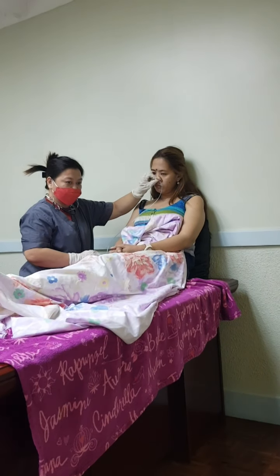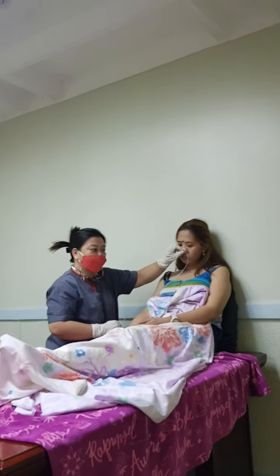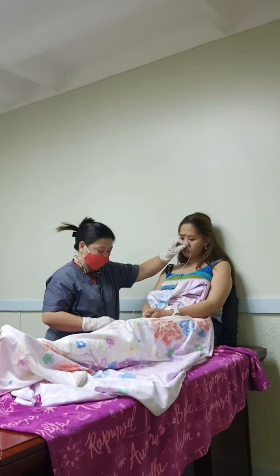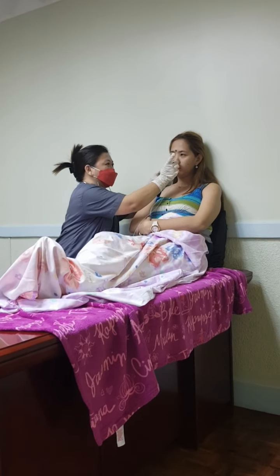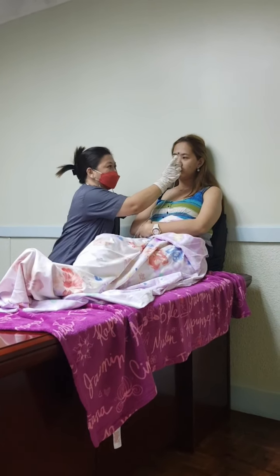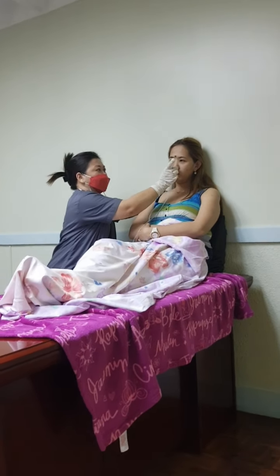This reduces irritation and the likelihood of mucosal injury. The client may gag when the tube reaches the pharynx. The gag reflex is stimulated by the tube.